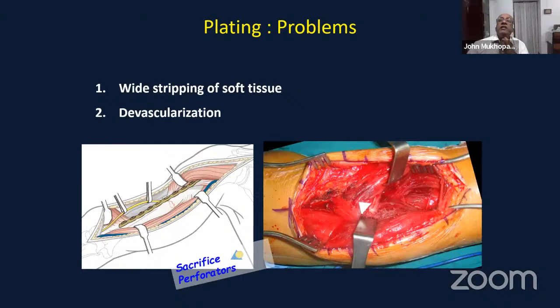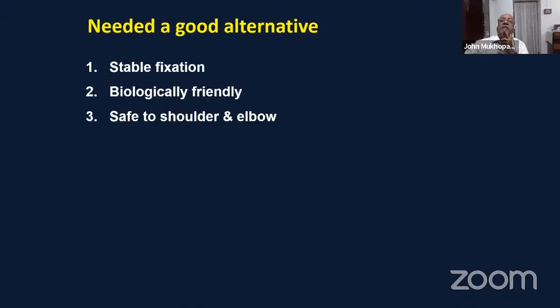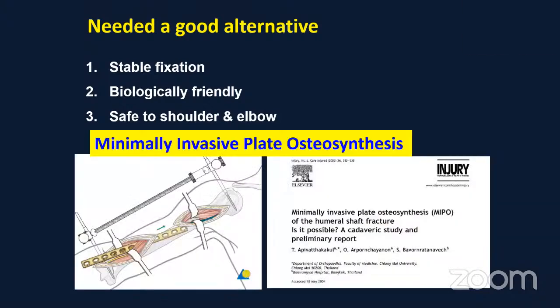When it comes to open surgery for plating, I think they work well in terms of healing, but you do end up doing a fair amount of stripping of soft tissue, which may devascularize fragments, especially in a very comminuted fracture. So there is a need for a good alternative, which provides you stable fixation, which is biologically friendly and safe to both the shoulder and the elbow.